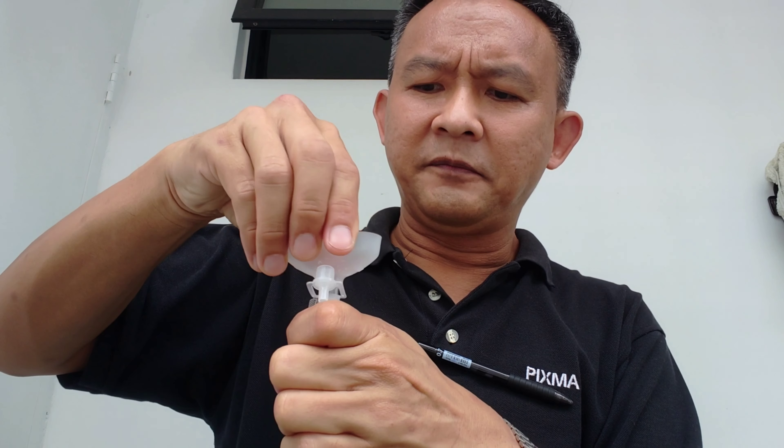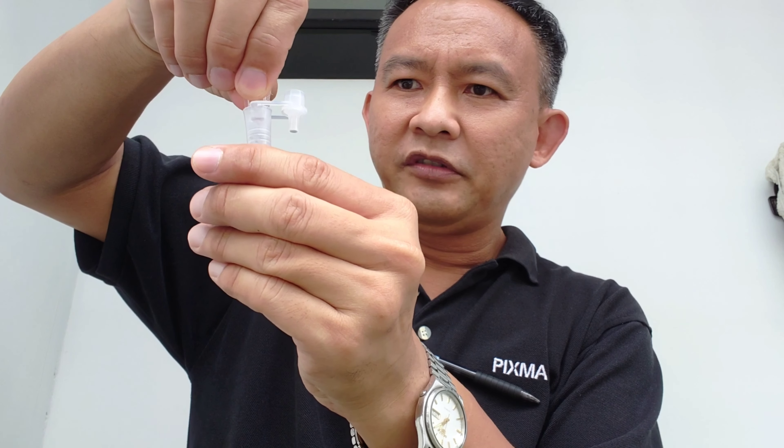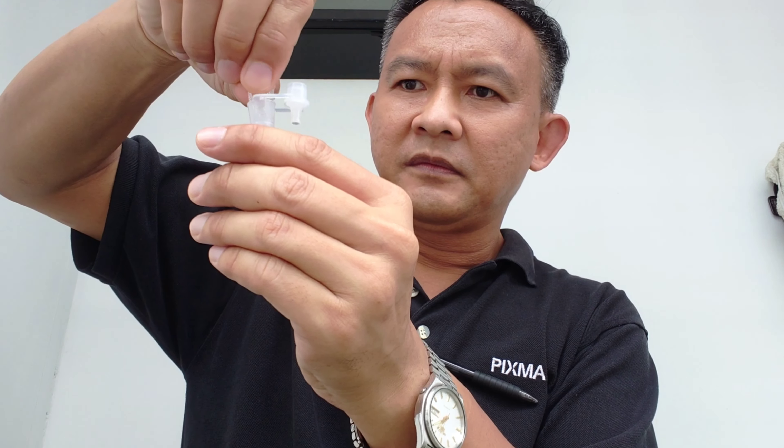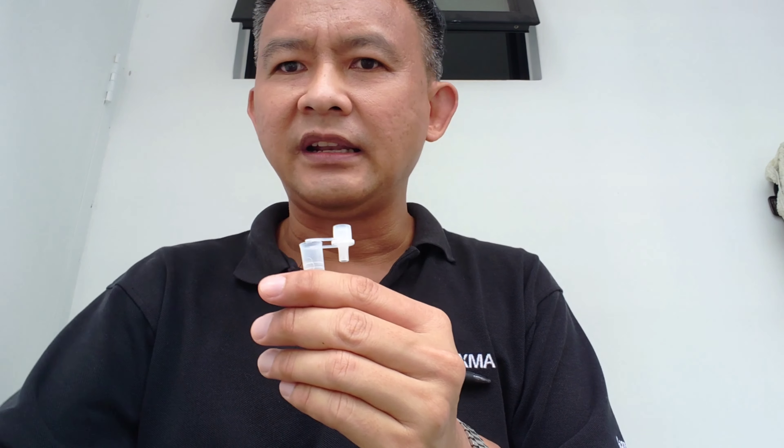I think I can take off the panel — I don't need it anymore. And squeeze the entire buffer into the container. Okay, that's it.